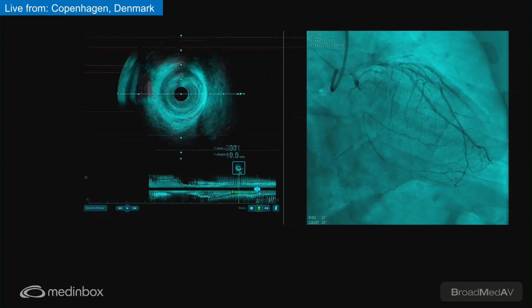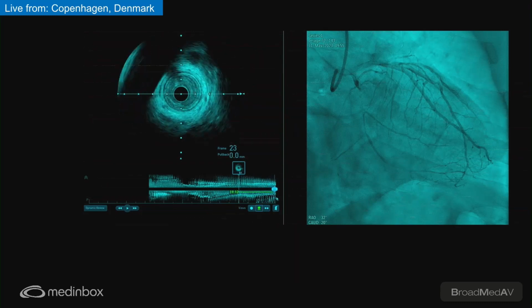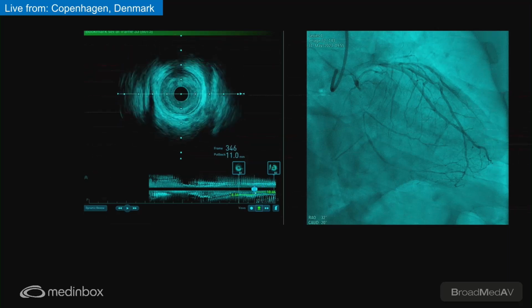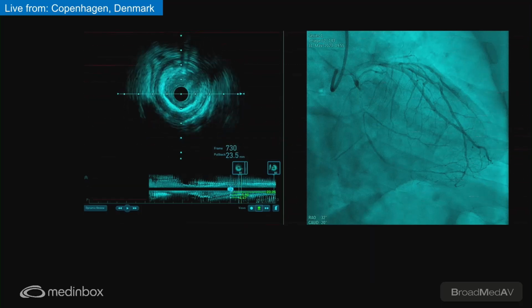You have 20 millimeters to stent at least from there, because you have to stent all the way down to where you started. Here's a landing zone. So we measure here from media to media. It's 2.5. Can you measure it just in the middle? Just distal here it is 2.95. So that means you can go with a 2.75 stent there.